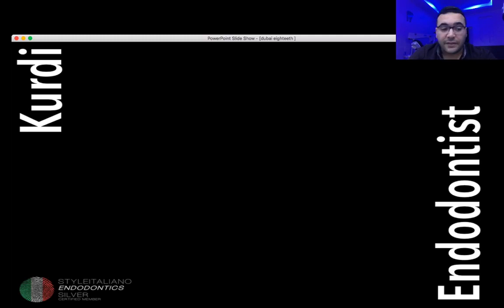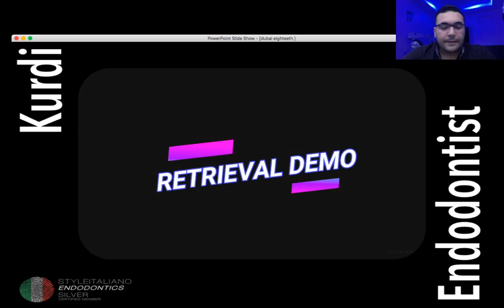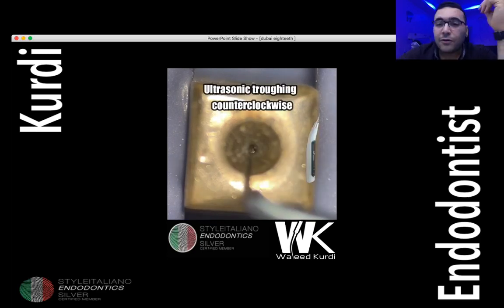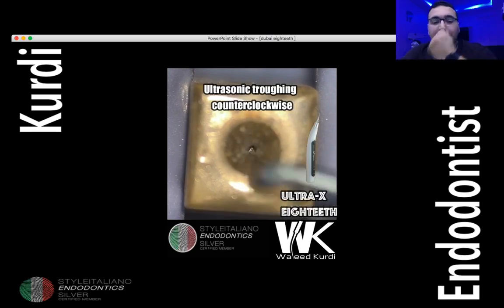Here in this video, because I can see that a lot of people are asking about my protocol of retrieval, I will show you how I remove the files in my clinic. Here you can see I have a file. Here is Bella Ciao. I will just decrease the audio a little bit.